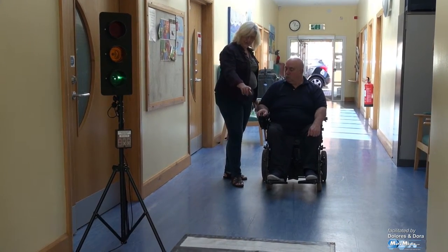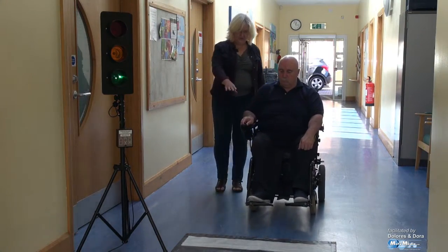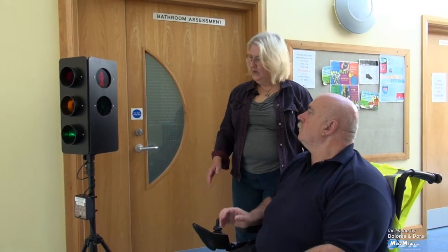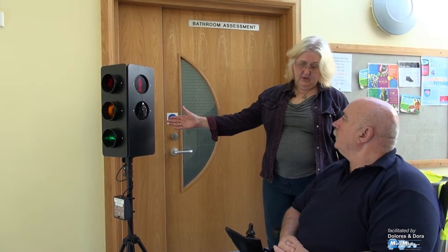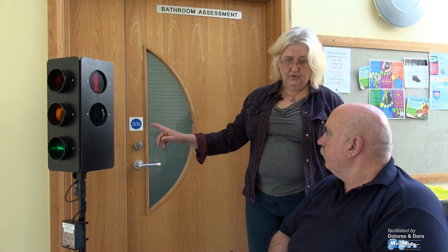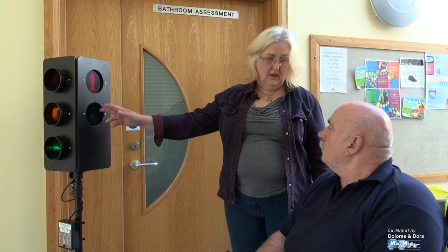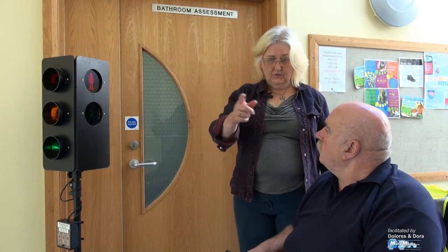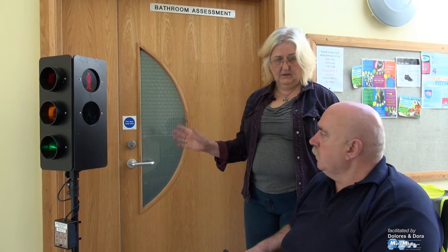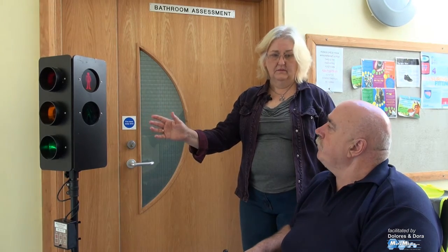Right David, you're ready to drive, so just start forward to the edge of the mat. Now we have the pedestrian light. We have to pretend that there is traffic passing across the zebra crossing and you need to keep an eye to see what's coming and what's going. I am going to turn the light so that it will go to the green man, at which point you need to check the road — right, left, right again — look and listen and proceed across if it's clear as quickly as you can.